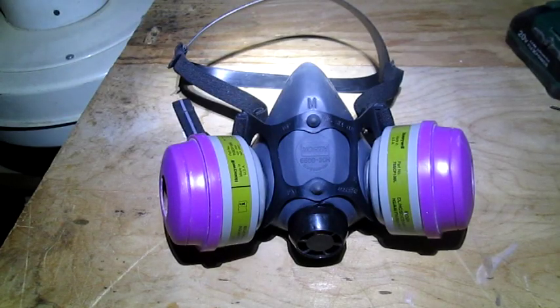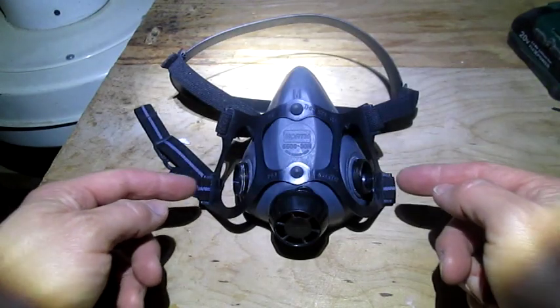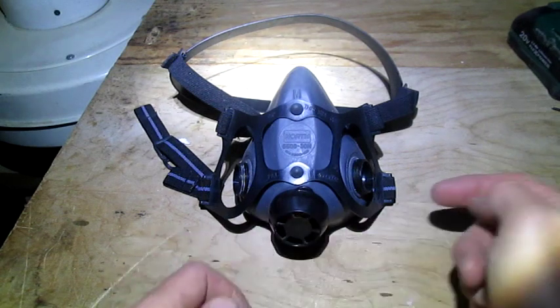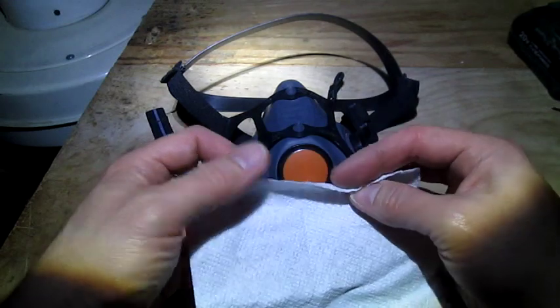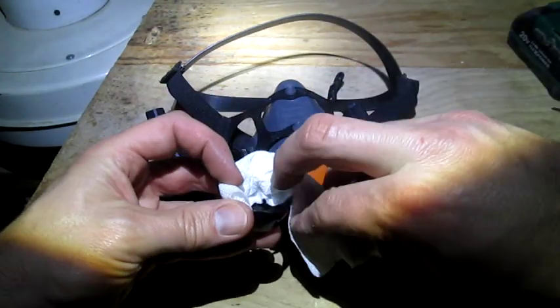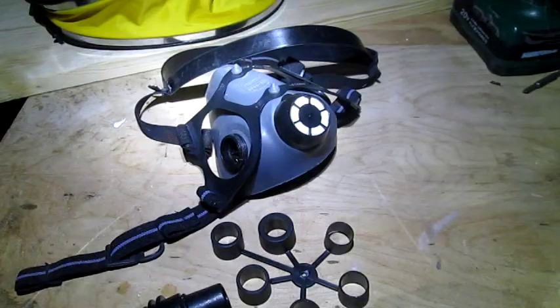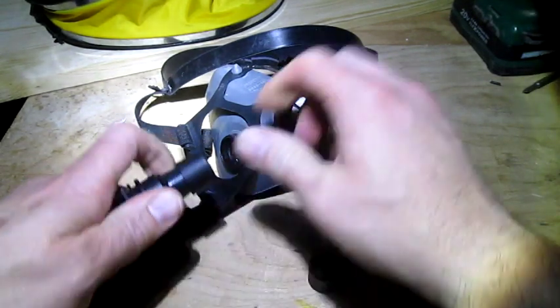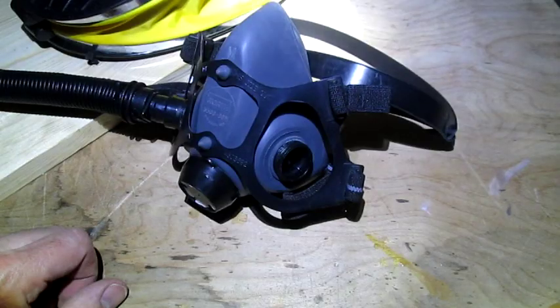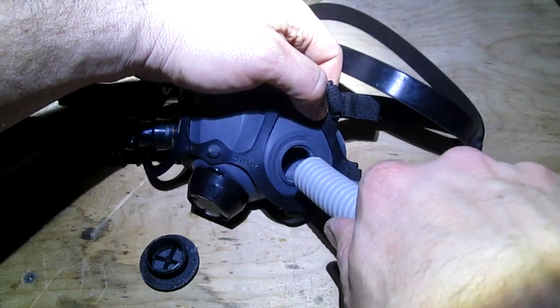Now we need a mask. We'll start with this respirator and unscrew the filters. Air normally goes in here and out here, but we're going to block this and send air in here and out here. So we'll pop this off, take a paper towel, roll it up, bunch it inside this cap so that when we put it back on, it'll hold this flap tightly shut. The inhale side is really easy — the pump comes with all these adapters, so we just pick the one that goes on here and fits tightly in here. For the exhale side, we need to pop out this connector and then force our pipe into this rubber hole. And there's our ventilator.